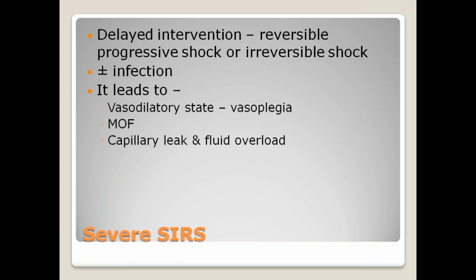So what I say is at 3 liters of flow, suppose your venous saturation is 75, your lactate levels are normal, your mean arterial pressure is 80, then you don't require to keep mean arterial pressure of 80. You can come down to a flow of 2.75 and maintain pulsatility and accept mean BP of 70, accept venous saturation of 68, 70. Fine, because then you are avoiding cardiac stun. But if at the flow of 3 liters your mean BP is 60 or 55, your venous saturation is still 50, then there is no point in thinking about pulsatility. First think about adequate support.